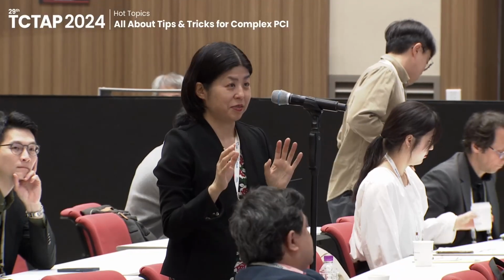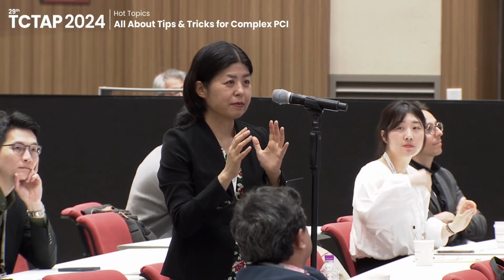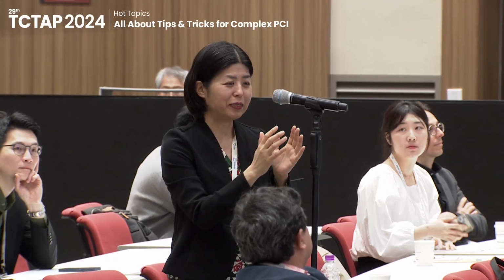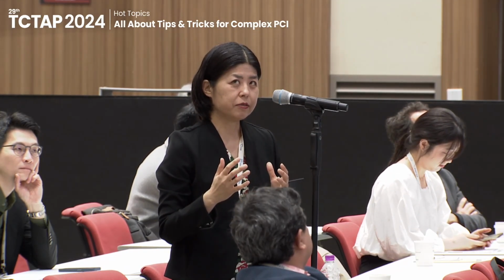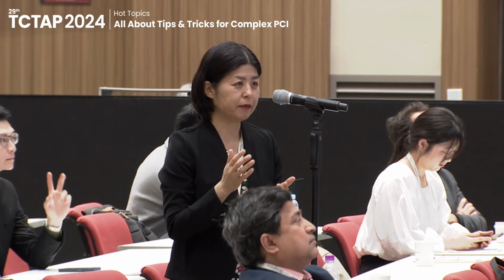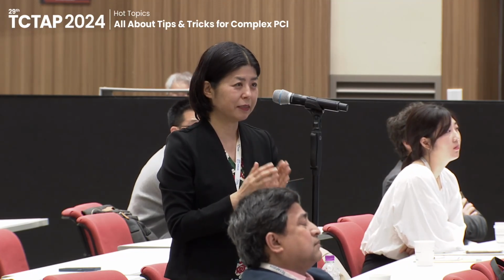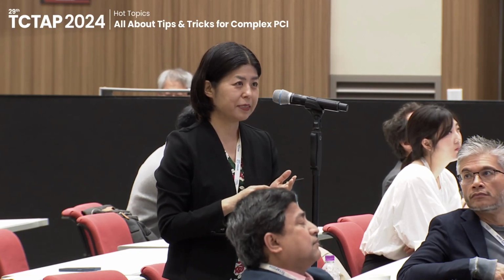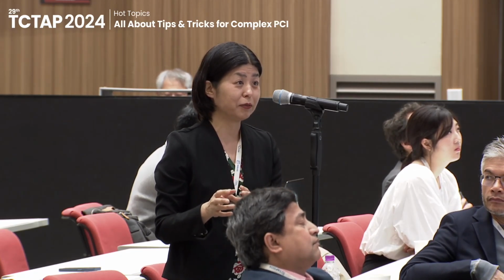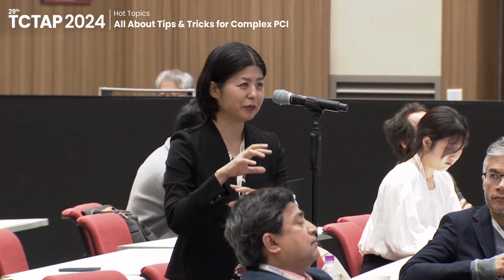Okay, I think nobody knows, because even the pathologists tell us, based on one snapshot, they don't know what is the beginning, what is the end. But we have about 340 cases having both baseline and follow-up, 2 times OCT. And all the cases had calcified plaque at the baseline, no calcified nodule. And then we see 7% of the cases newly developed a calcified nodule at the second time. At the baseline, nothing; second time, a calcified nodule on the top of the calcium.